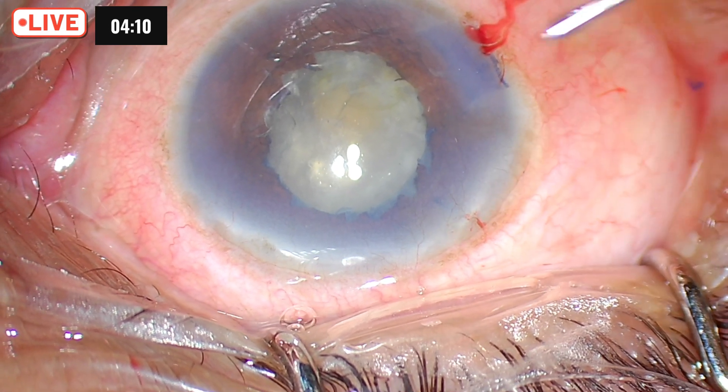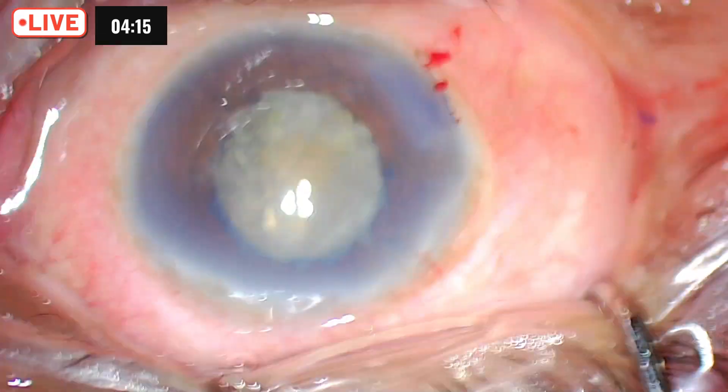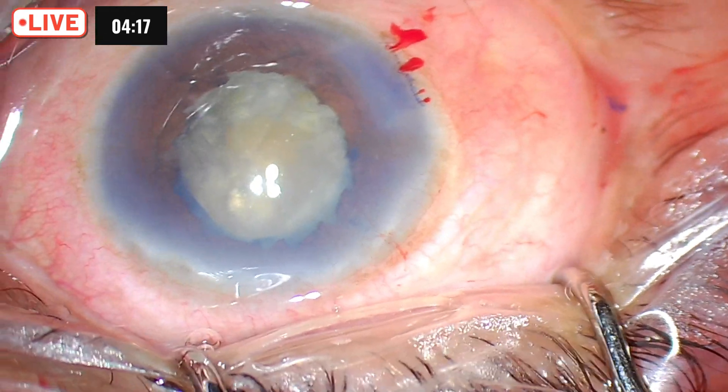All procedures will be done under viscoelastic even into the anterior chamber, because I don't want sudden shallowing or sudden deepening of the anterior chamber. You can notice the cornea is already very compromised.